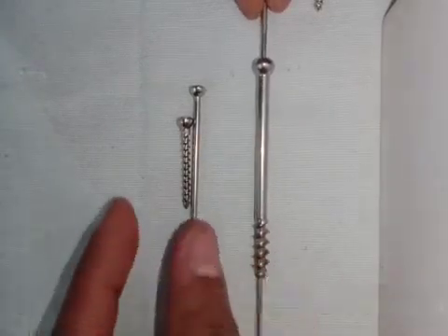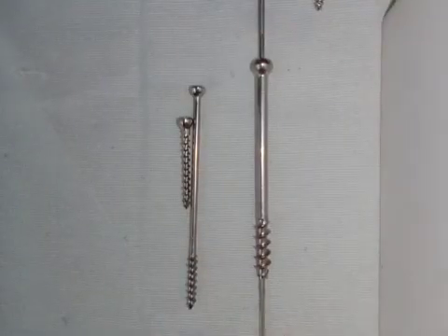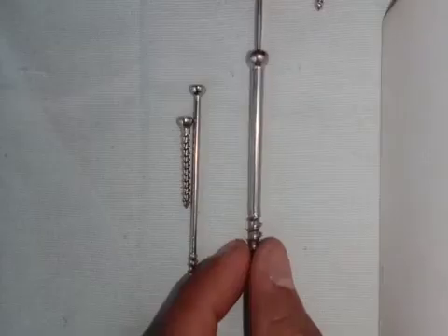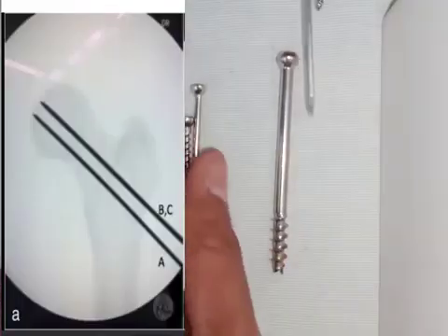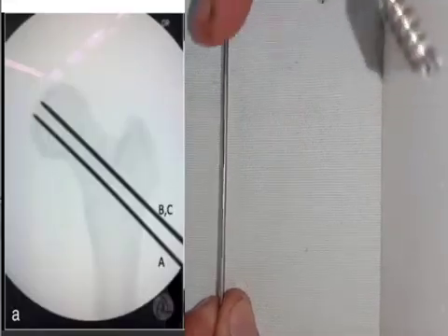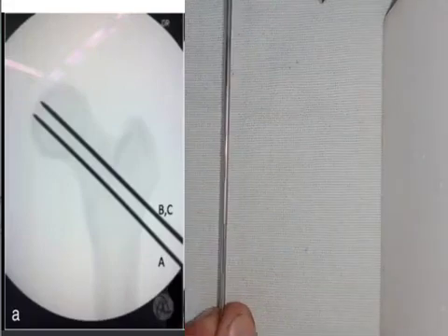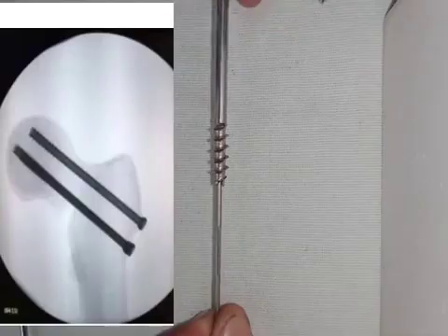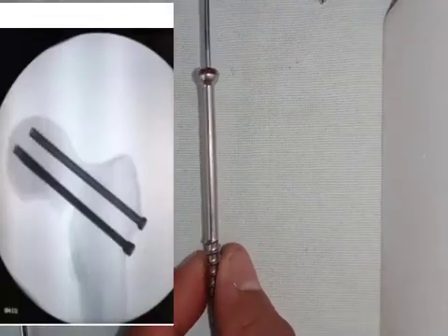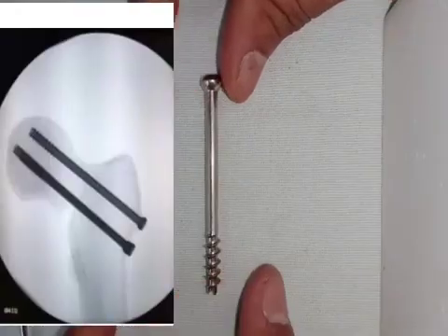The cannulated cancellous screw is used in special applications. If you want to know where the screw is going before you insert it, you first put this guide wire into the bone. Once the guide wire is introduced, you use a special drill to drill through the bone. Once you are satisfied with the position, the final step is inserting the screw over the guide wire, after which the guide wire is removed. This is called the cannulated screw system.